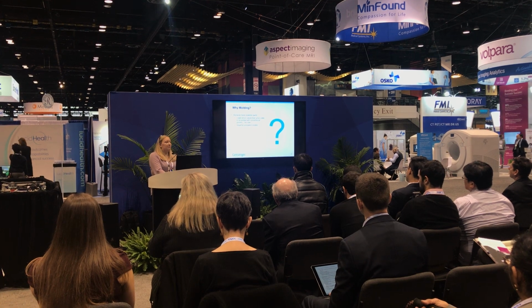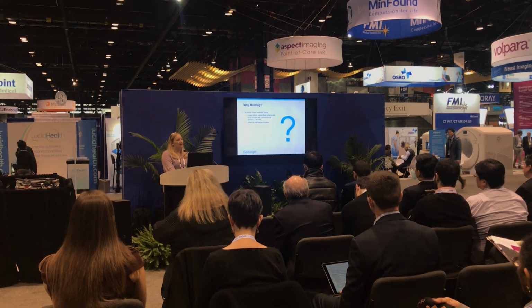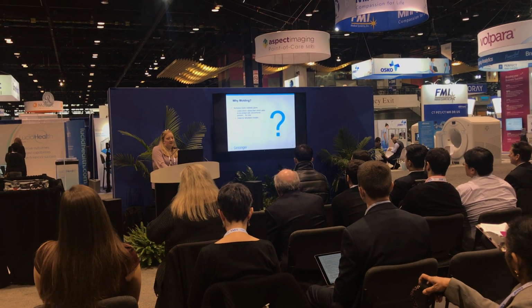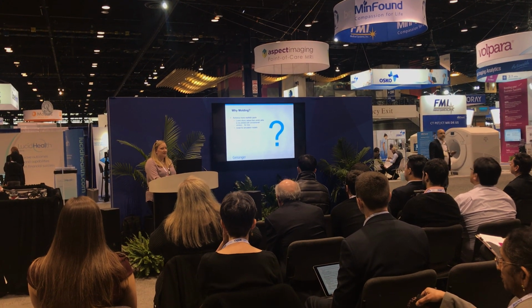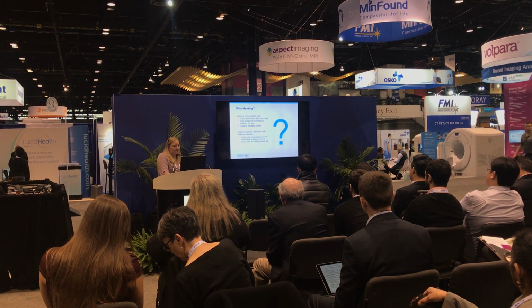So you can achieve more realistic parts right now. Some of the printers are not available to have those realistic models yet. So that's the only other way we can do it. We can pump some silicone into some molds, and this is great for simulation models because why would you not want to simulate realistic tissue?